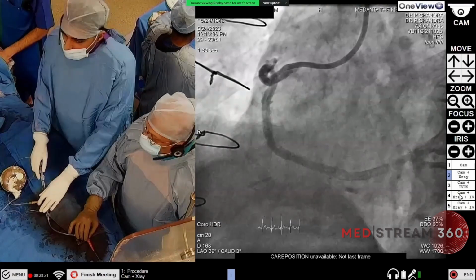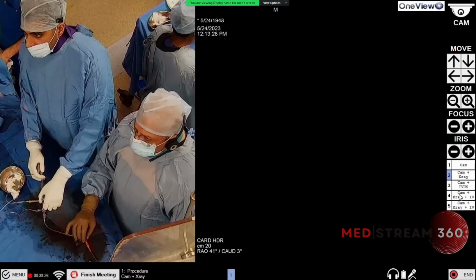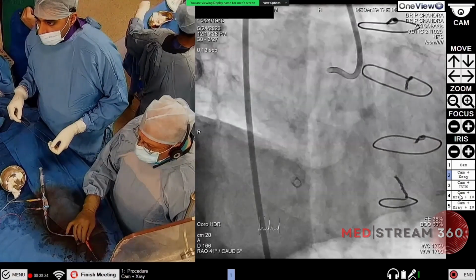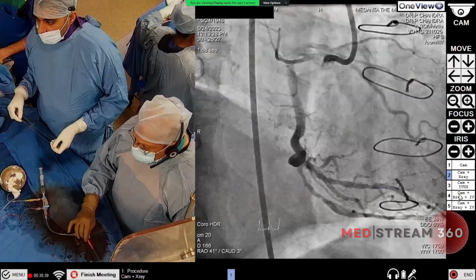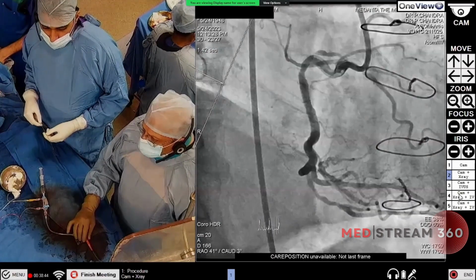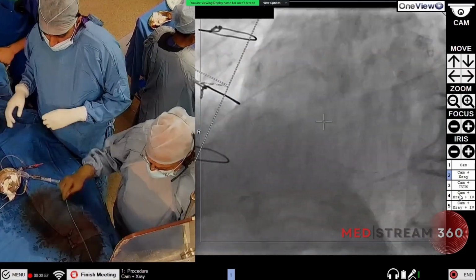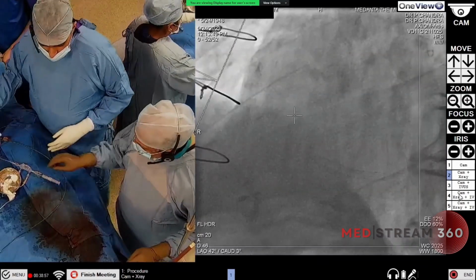So go to Elio, and so we will take this catheter, okay, quickly, and we can now do an Angio-Seal. Yeah, I'll just also demonstrate this Angio-Seal because in India, not. So before doing an Angio-Seal, I have to do a shot to see whether we have punctured the CFA, not the profunda or something. Because if it is profunda, then we cannot do this.